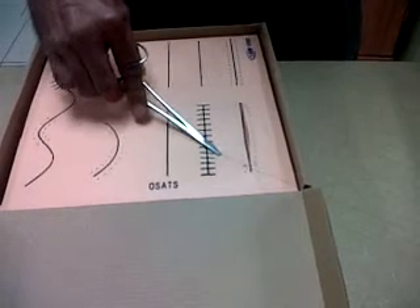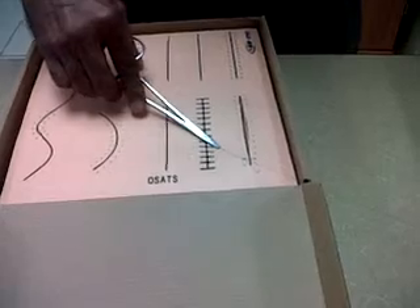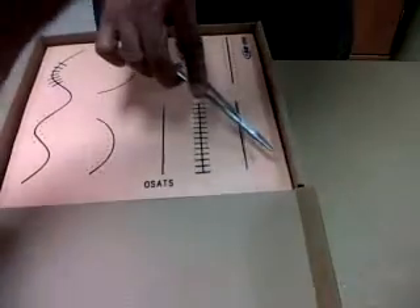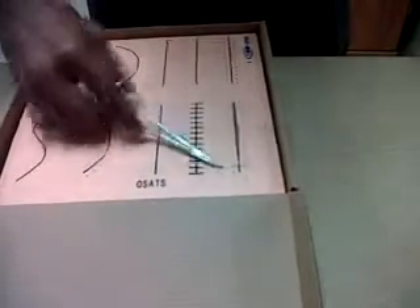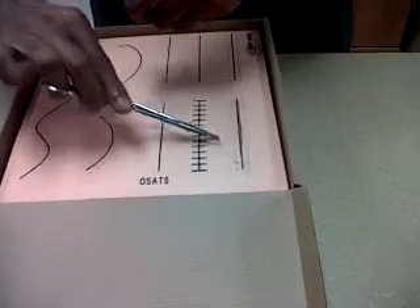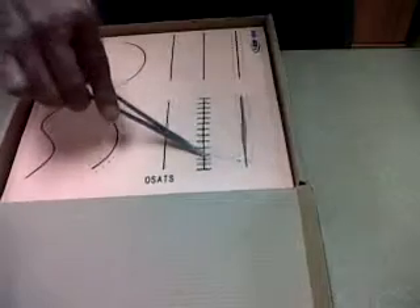Catch hold of the other end and pull it out — this is a simple stitch. Our aim of suturing is to ensure neat apposition of the epidermis and the dermis so as to give healing by primary intention. This is the simplest and fastest technique. Remember, for nylon we have to give at least six throws, otherwise it tends to slip, and each loop should be opposite to the previous one so that it does not slip.